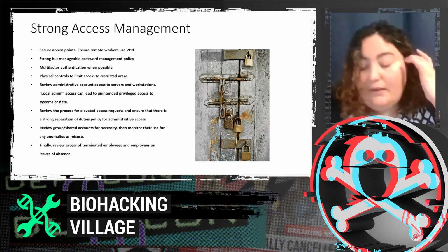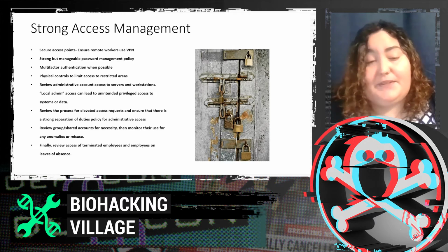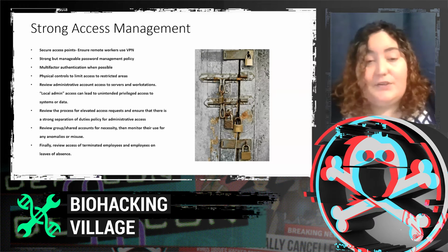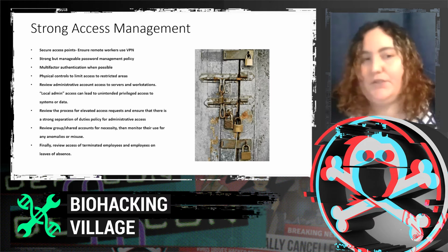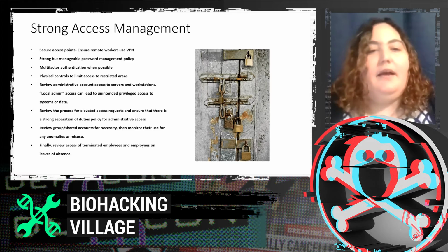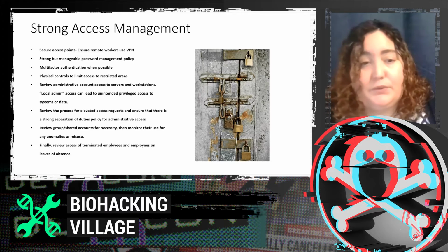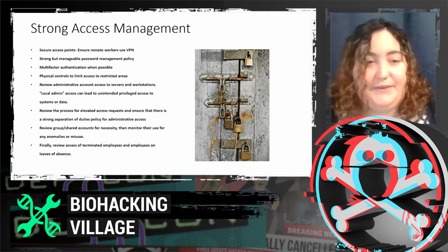I understand that it is very common in a lot of workflows in a hospital for staff to use their badge already for access. So having them switch to badge and PIN is not a stretch. It would be within a normal workflow.